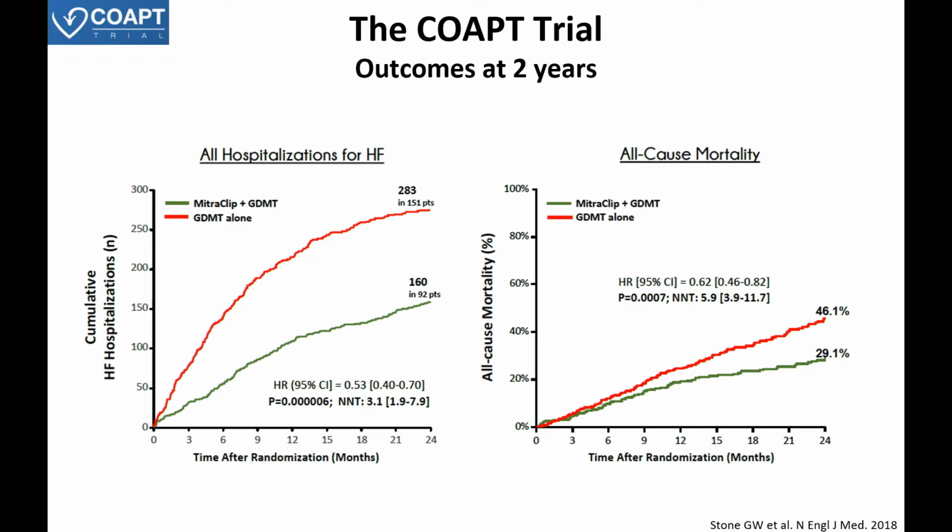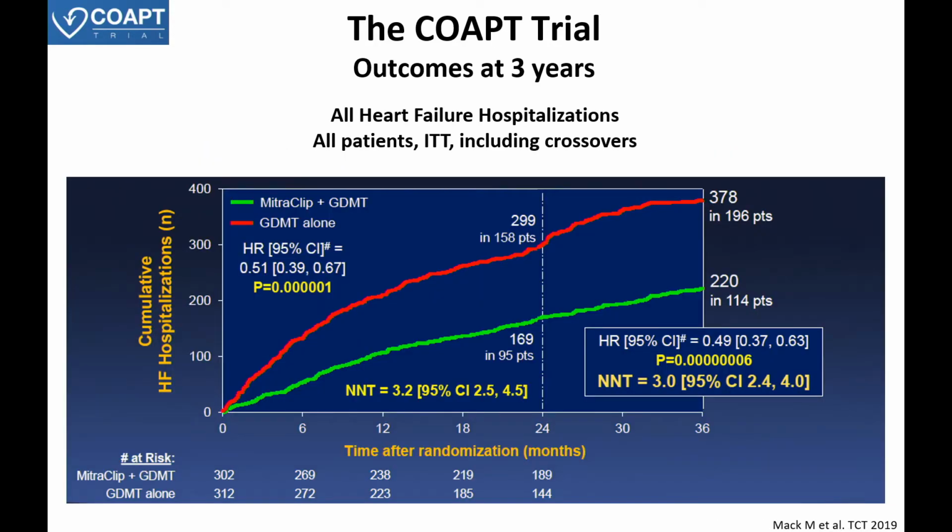COAPT was actually very positive, and positive across all the primary and pre-specified secondary endpoints. Here we are just showing the impact on all cumulative heart failure admissions on the left and all-cause mortality. We also know from COAPT that the benefit of the MitraClip in this particular patient population is stable. It's preserved also up to 3 years.